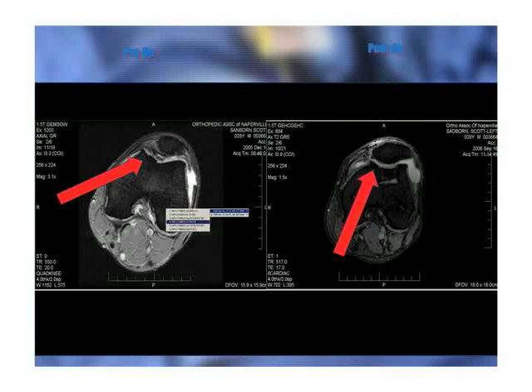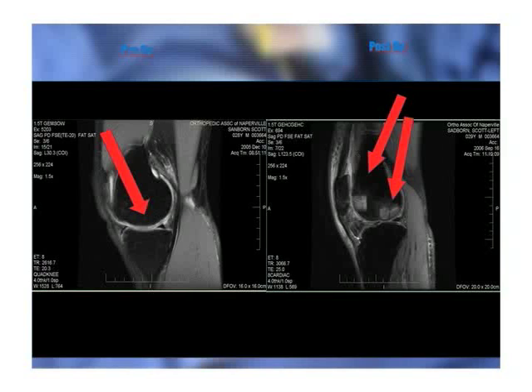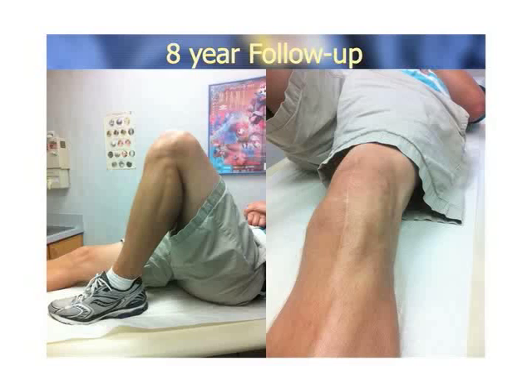So you can kind of see the post-op MRs here with the cartilage transplant, basically post-operatively here, resurfacing anatomically the sulcus terminalis. He actually came to my office about 3 weeks ago for follow-up for his wrist, and I was able to snap a few pictures of his knee. He's not swelling anymore. He's doing well. He did not want to get x-rays. He wasn't in for his knee. He was in for his wrist. So in this instance, we were able to definitely buy him some time for further treatment, and he's had a good result.